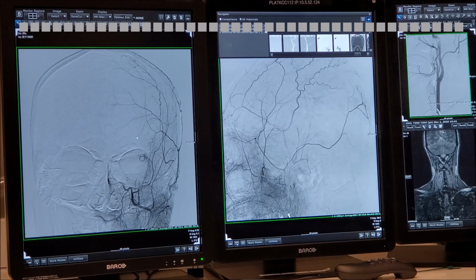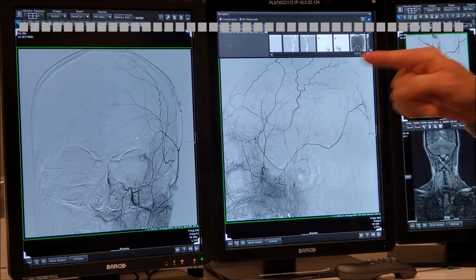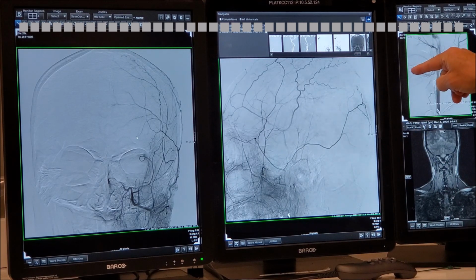We used to use Fogarty catheters. I use a Foley catheter, you know, the red one. There were no endoscopes in those days. Yeah, it works very well. There was a neurosurgeon who was chief resident at NYU, Max Kozlo. We were at Bellevue. There were no CTs yet. Only NYU had CT. We had a lot of trauma there, and we lined the patients up in the angio room. This is how I learned how to do burr holes, because Max told me, he would do angio. He's a neurosurgeon.